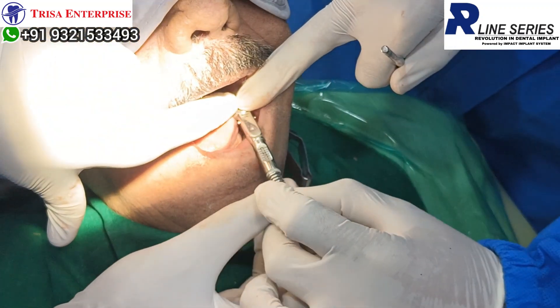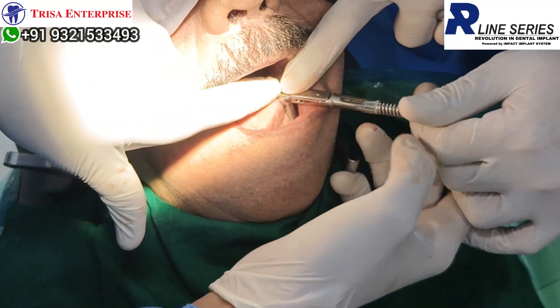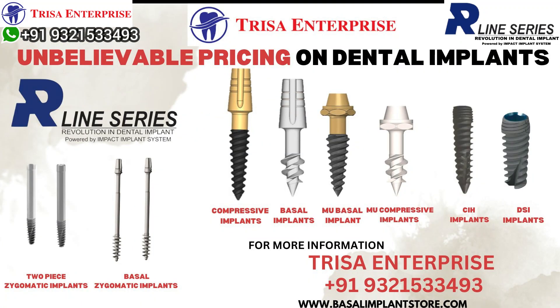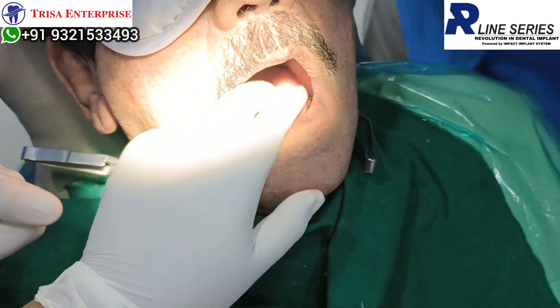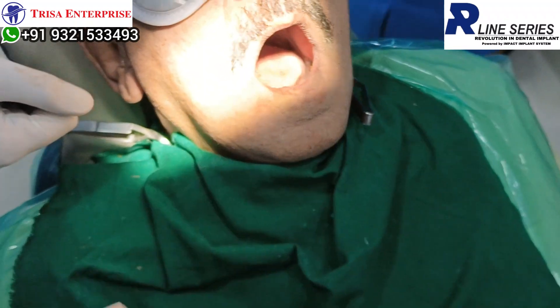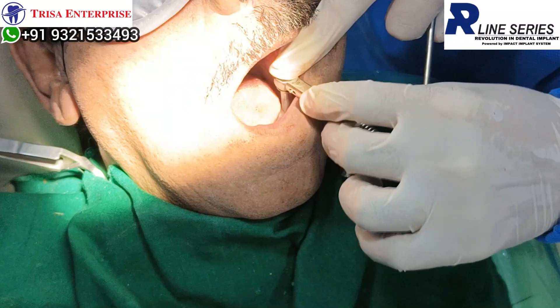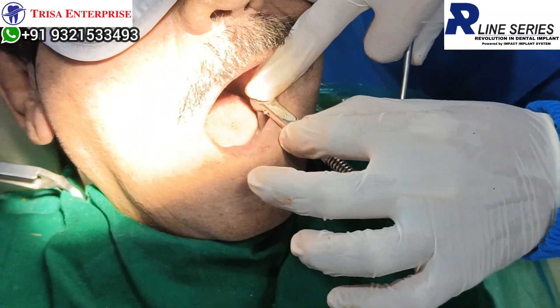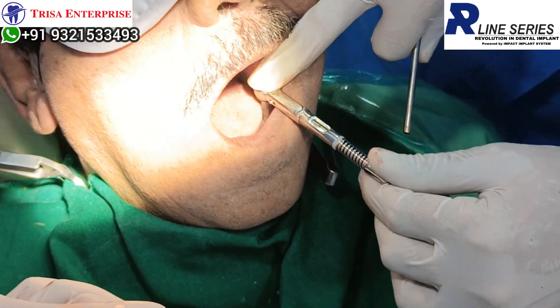See now what sir is doing — no need to make a full circle like this, this is not helping. You just keep it like this. No need to make a full circle. The moment you take half a turn, it's done. Then see this — the click. You will hear a click.